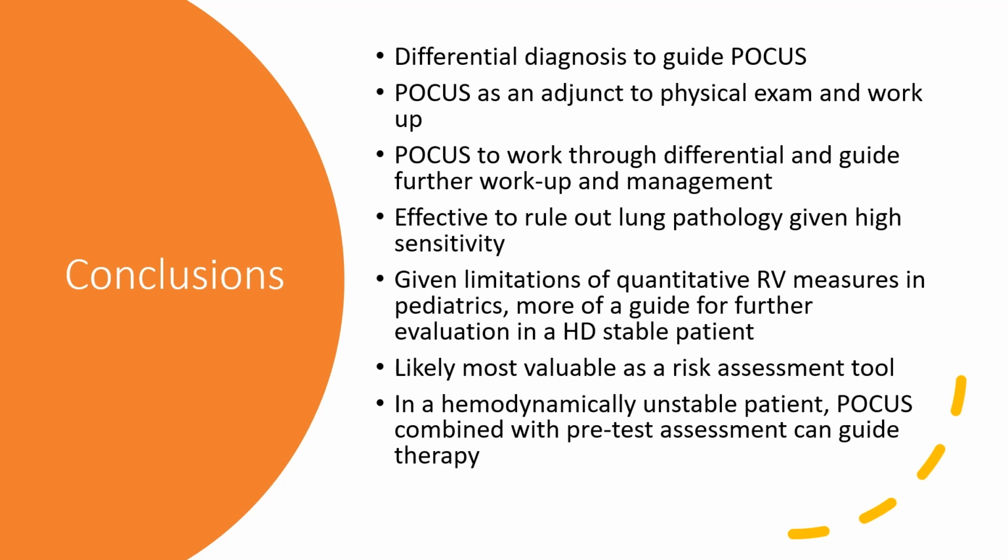But if this patient was hemodynamically unstable and you don't have time for further studies, POCUS in an experienced user can be a very quick and effective tool to help guide necessary life-saving management.